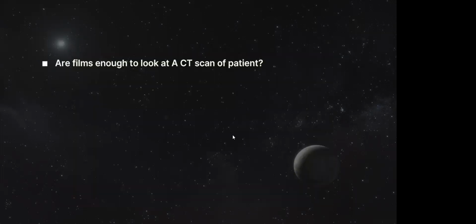And one important question I want to ask you people: should we look at the CT films to interpret them? I have seen CT films from different institutions, from government hospitals, where they only give like 16 or 17 images, and you have to just take a decision about that. Do you guys agree that we should interpret the CT images? We can interpret the CT image in a film, and it's totally okay to do that. You can tell me in the chat probably.